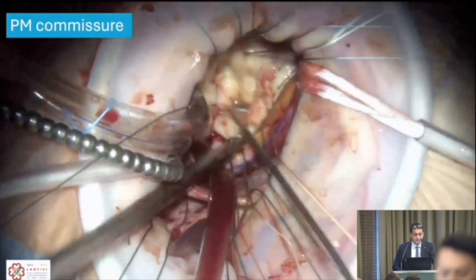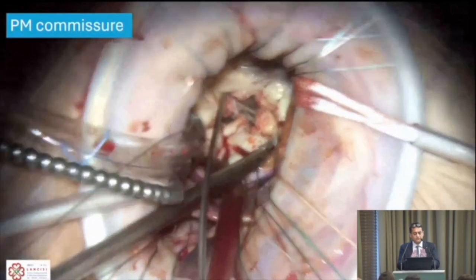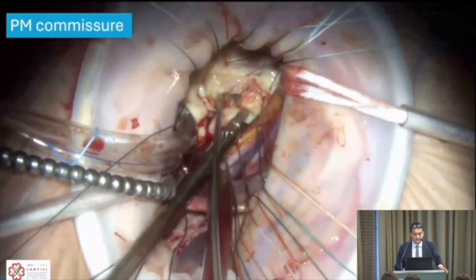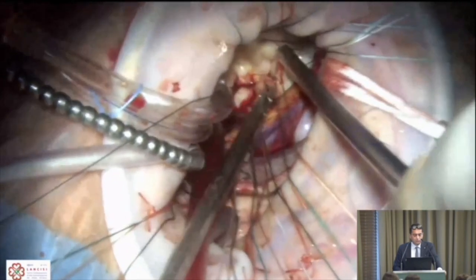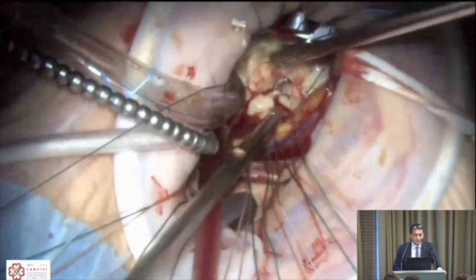Reassessing the commissure, we find a P2-P3 cleft due to the infection, and the commissure is completely destroyed in that area. We decide to keep it simple: close the P2-P3 cleft and address the commissure with an edge-to-edge technique. The valve is large enough that this presents no difficulty.